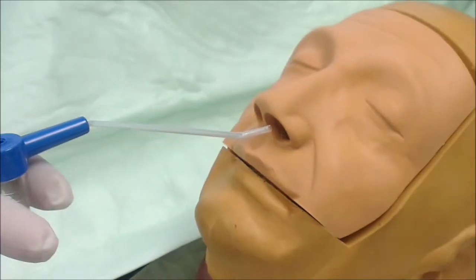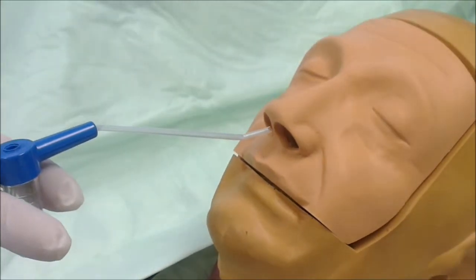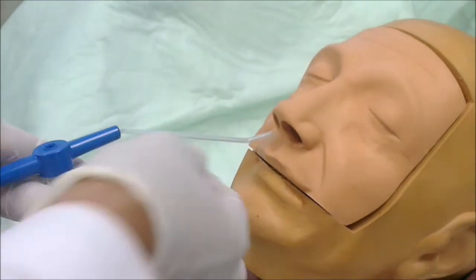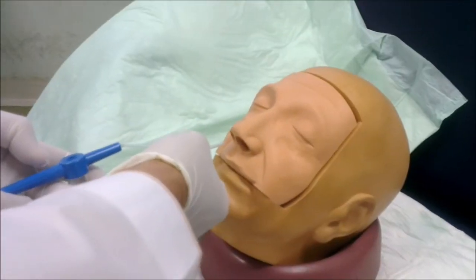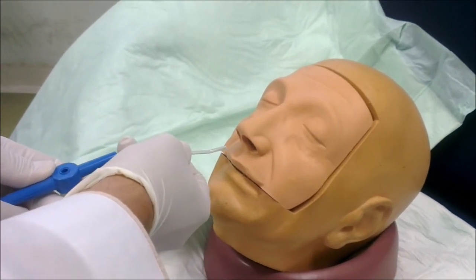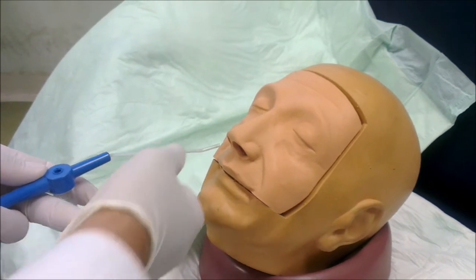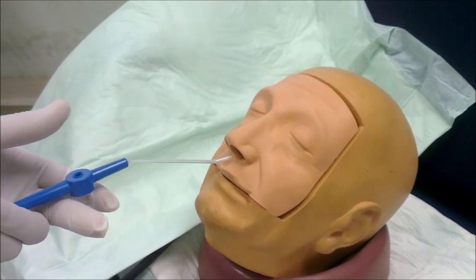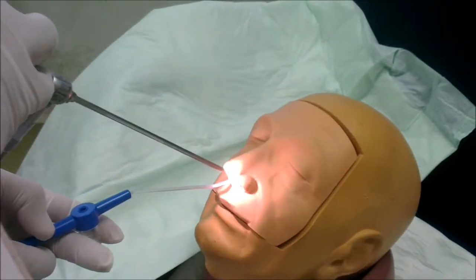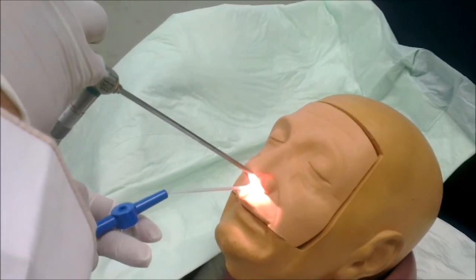So in order to collect the purulent secretion using the suction collector, you should avoid putting your finger on the control while getting in. You have to keep the shaft covered on the tip of the suction, and when you go into the purulent secretion, then you allow it to open so you avoid contamination of the nasal cavity. And then you take your endoscope, which is preferably a 0 degree, and then you put the scope on top, and then the suction comes from below.